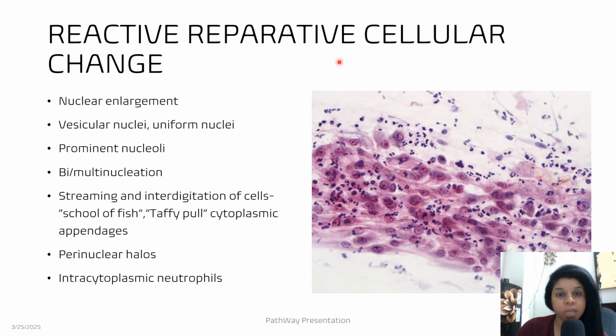Then you should know reactive reparative changes. So when there is reactive reparative change, that is especially when there is inflammation, too much inflammation or infection.